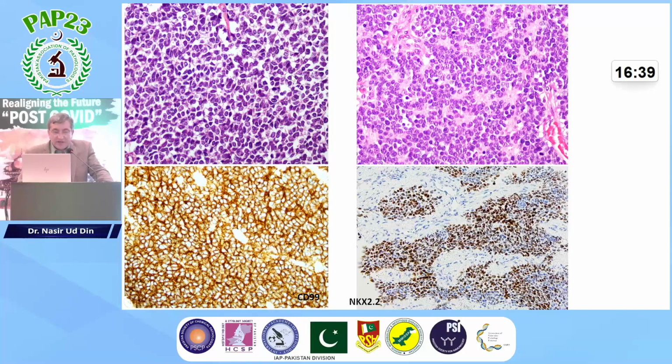Histologically, Ewing sarcoma is composed of a monomorphic population of small round cells arranged in solid sheets with scant eosinophilic to clear cytoplasm and little stroma. It can sometimes show Homer Wright pseudorosettes, which in the past have been called PNET. In 95% of cases, there is diffuse strong membranous CD99 positivity.